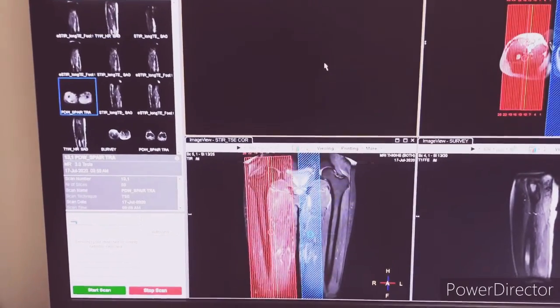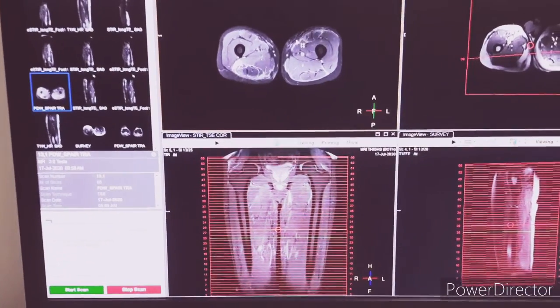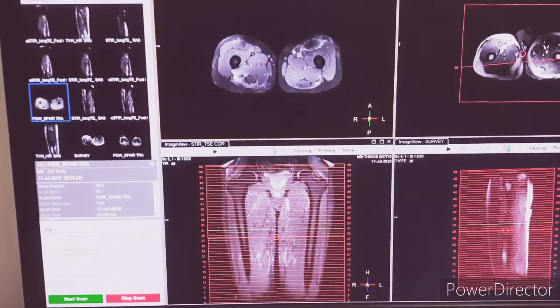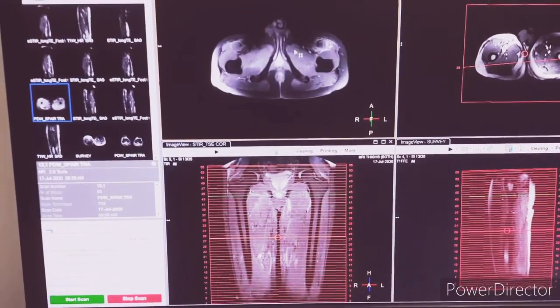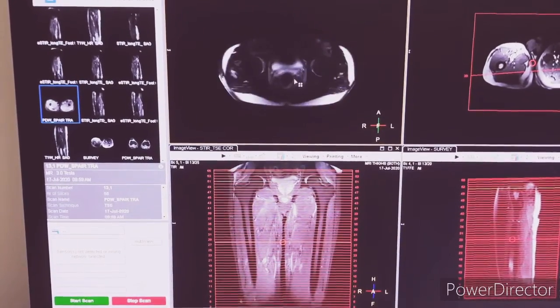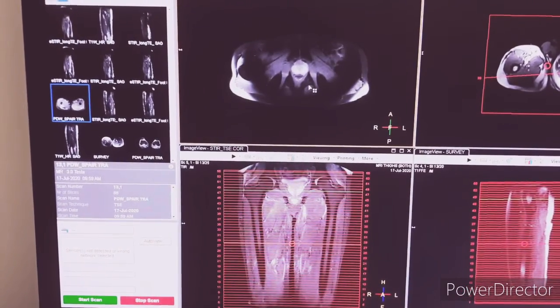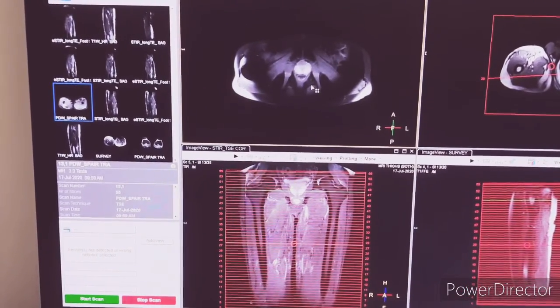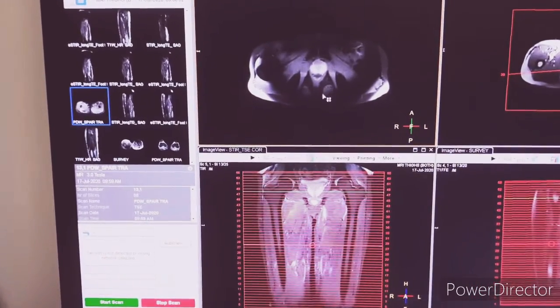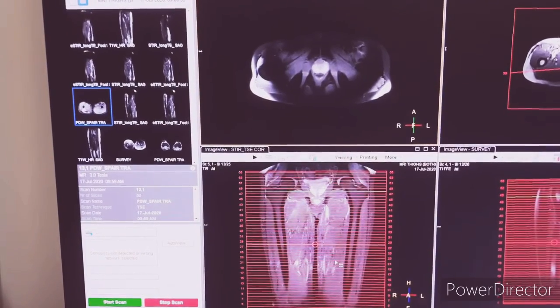The last one is PD-AXL. You can see we have taken it for both thighs. You have the option of taking it for a particular thigh — we can take it for the right thigh also, but in that case you have to increase the oversampling band. Here we have taken it for both thighs, so we don't have to give oversampling.